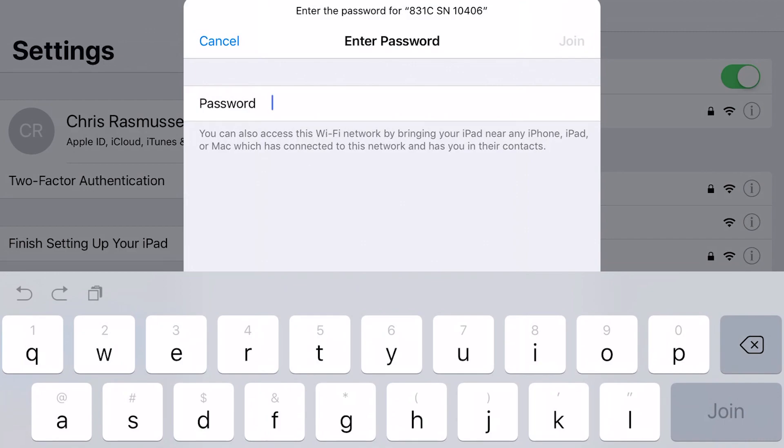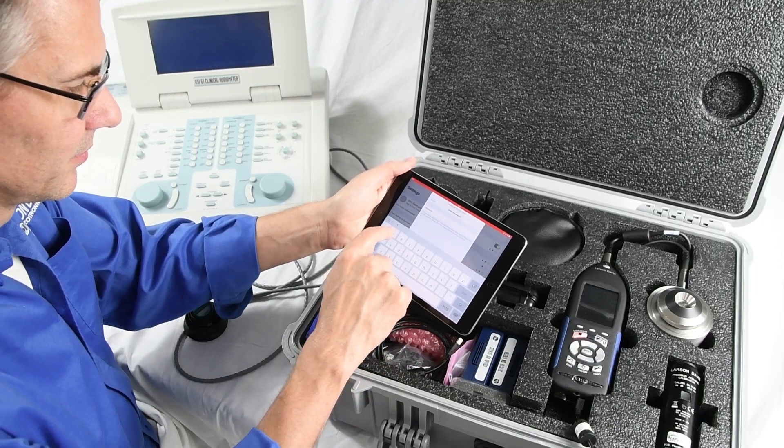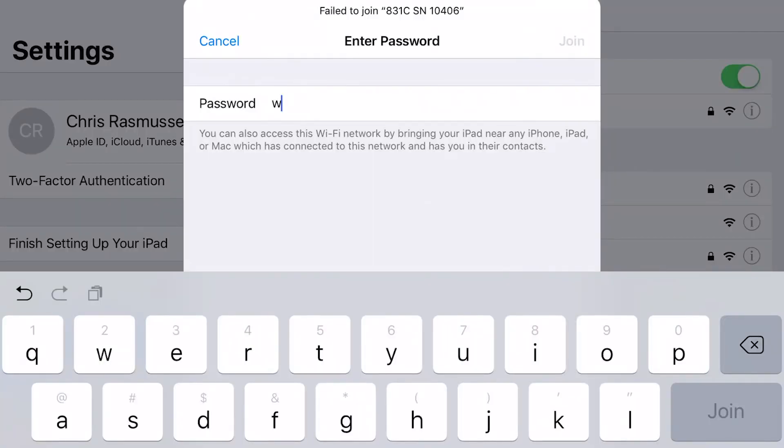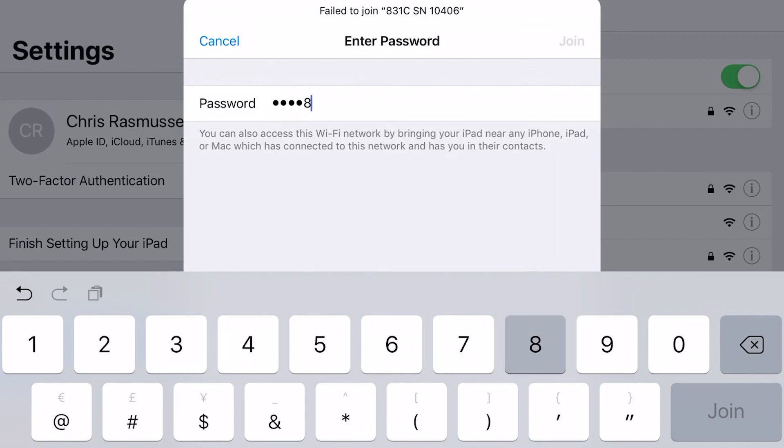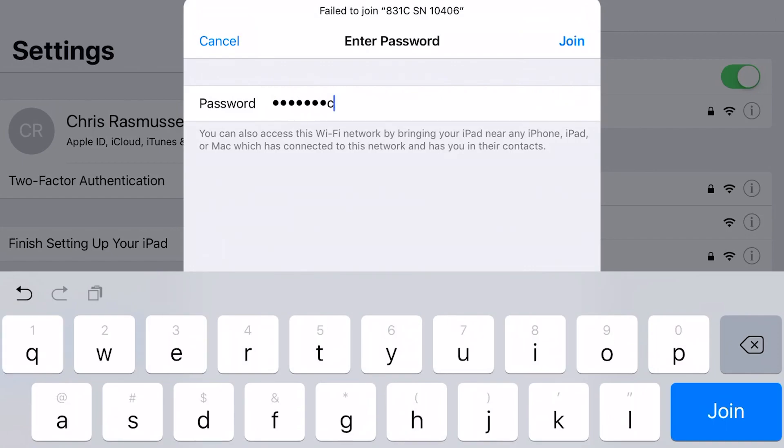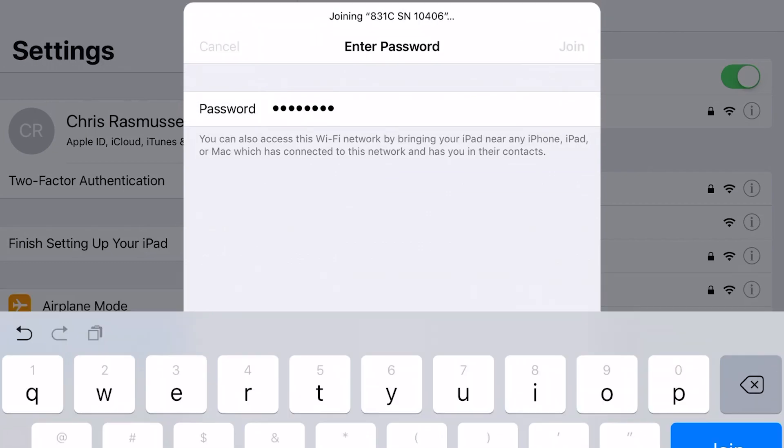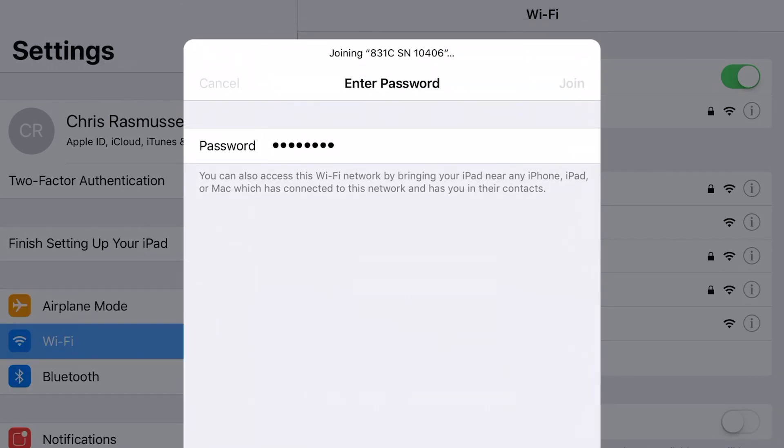The password is the same for any 831c device. It is Wi-Fi 831c, all lowercase. If you forget the password, it can be found in the AudCal and 831c manuals.